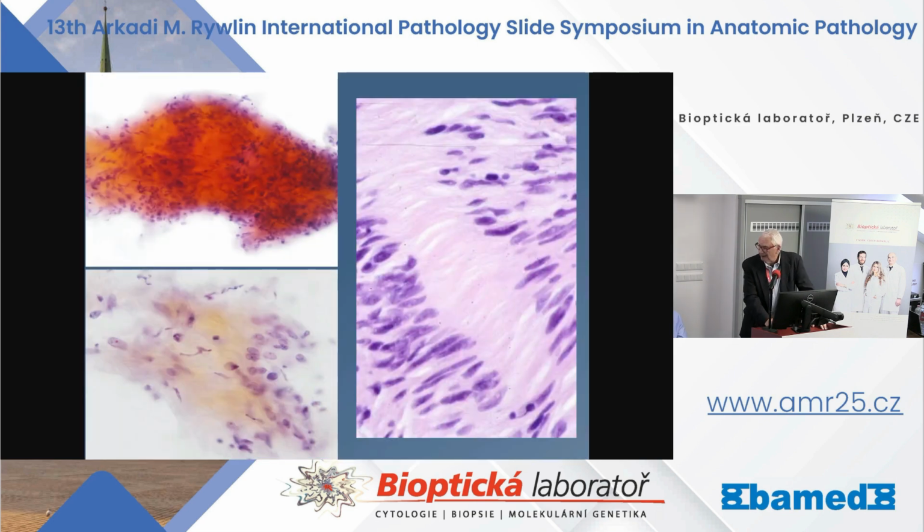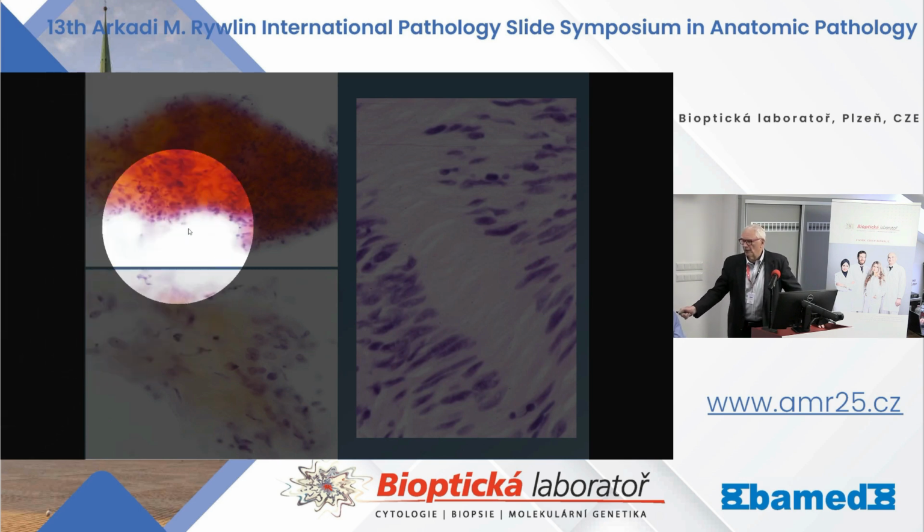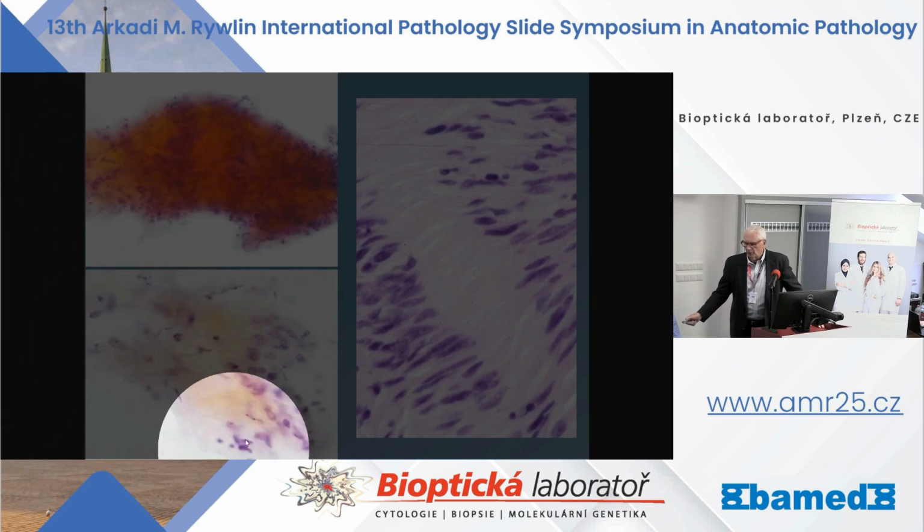Verocay body formation, very unusual. Typical Verocay body seen in tissue sections on the right-hand side. You notice those two examples, two different cases of schwannoma, where you get a vague appearance right in here with a palisading of the nuclei. And here's one right over here.